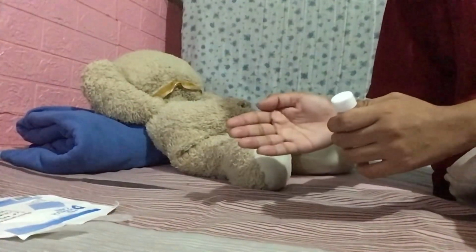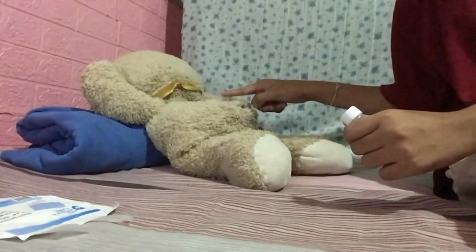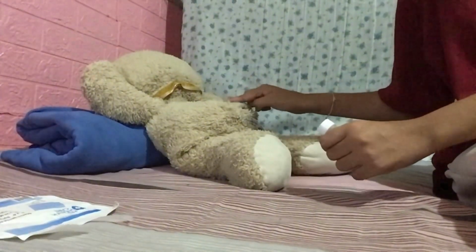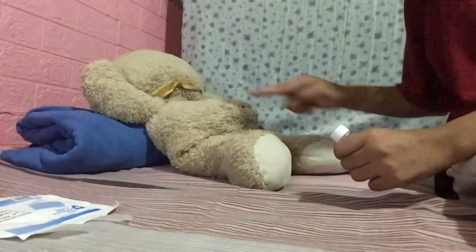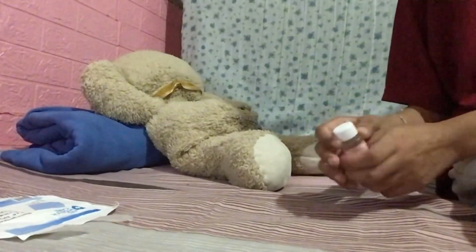If the doctor has prescribed an antiseptic ointment or solution, apply it to the wound as directed. Use a clean applicator or your clean hands to apply a thin layer over the wound area.